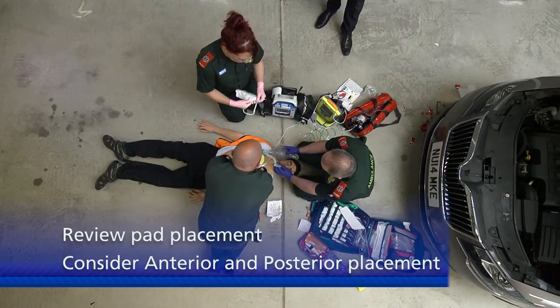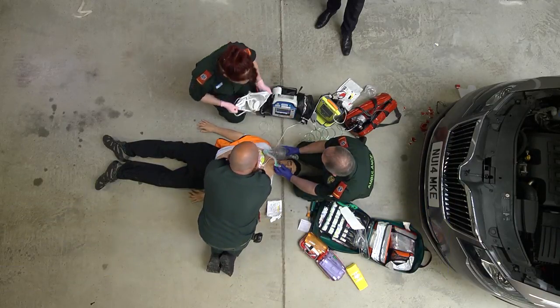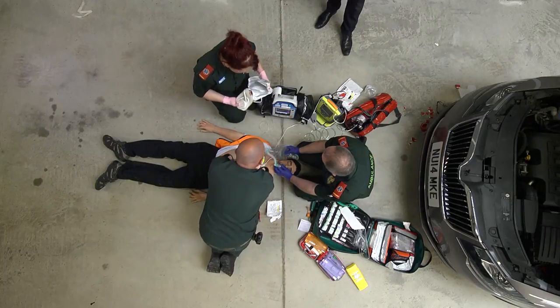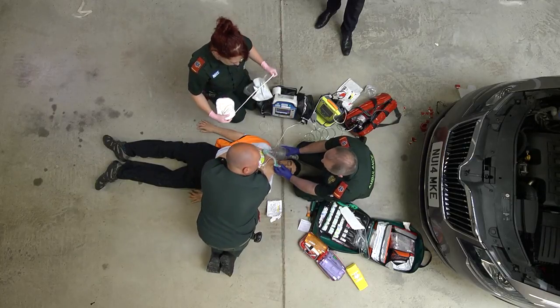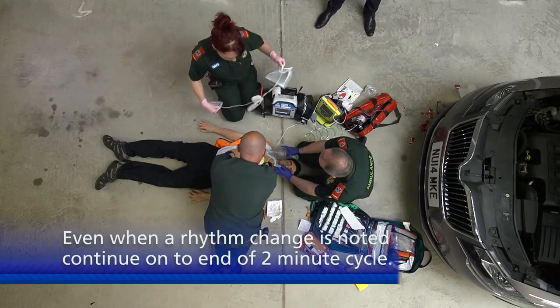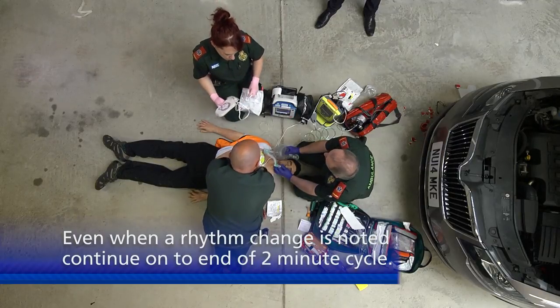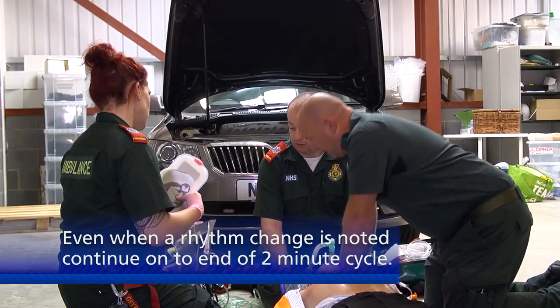Yeah, the filter's looking like he's just gone into a potentially rhythm compatible with life there, Steve. I don't know if you want to check that before we do. We've got about 30 seconds left on the cycle. Yeah. Shall I stop now? No, let's continue to the end of this cycle and then we'll have a look. But I agree, you're right, the rhythm has changed. It does look compatible there. Okay. So yes, let's keep going to the end of this cycle and have a look. Sean, do you want to just hold up on the pads until we've done this rhythm check?